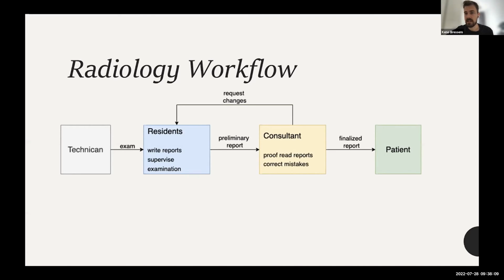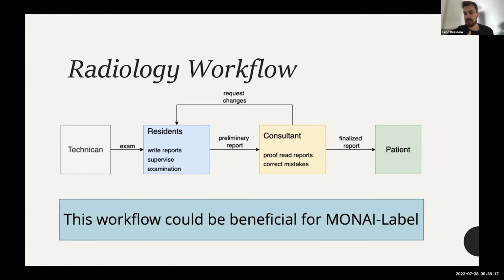So if you do labeling, usually you have residents, and usually they are early in their career, but they have more time. And that's why I also wanted to have this workflow in MONAI label, to have a reviewing tool, which Luke will now introduce to you, which allows more experienced readers to correct work of the not so experienced readers, but in a much faster way. So they can go through the images, approve the images, and maybe correct the images if necessary.